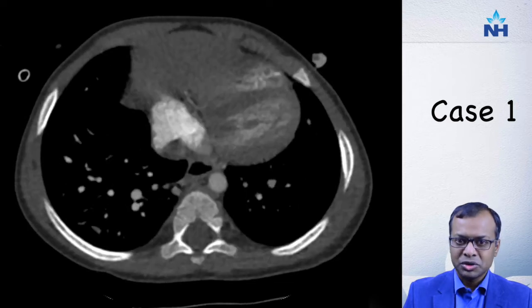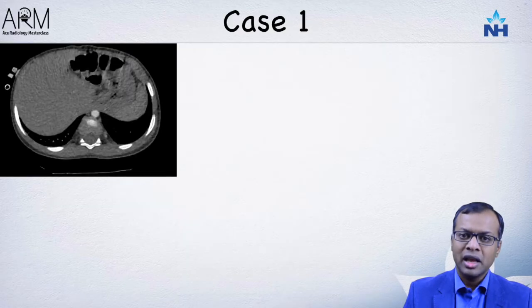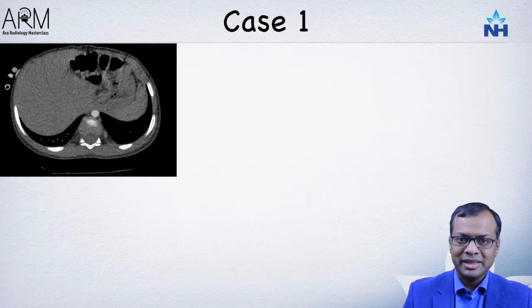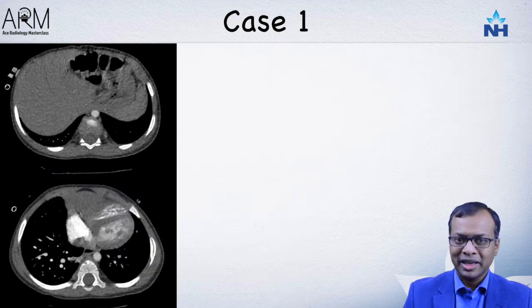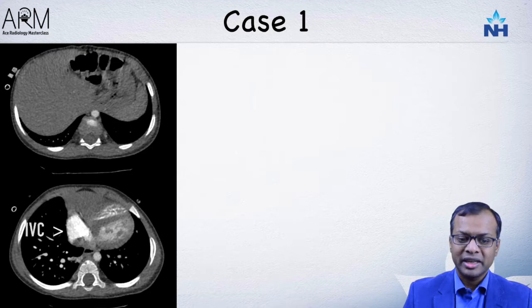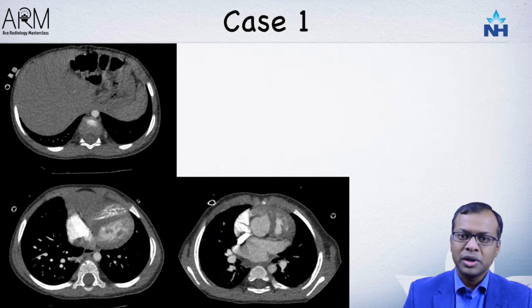The first thing I would do in assessment of congenital heart disease is to look at the location of the spleen and the liver. In this scan, this is the liver and this is the spleen, making it visceral situs solitus — normal visceral situs. Next I look at the systemic venous drainage: the SVC draining into the right atrium and the IVC also draining into the right atrium. So normal visceral situs and normal systemic venous return.